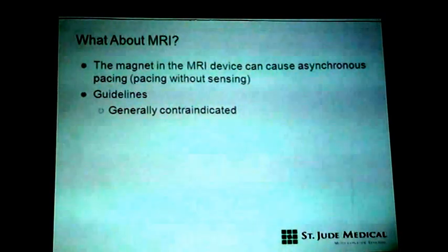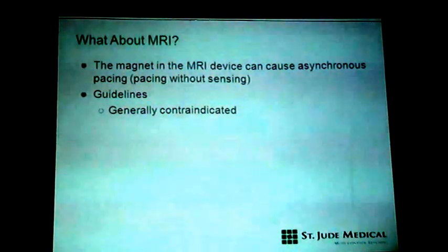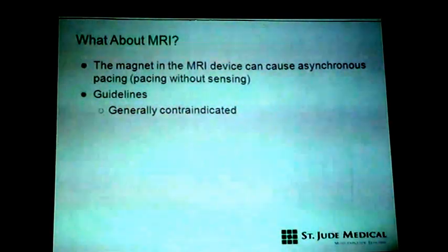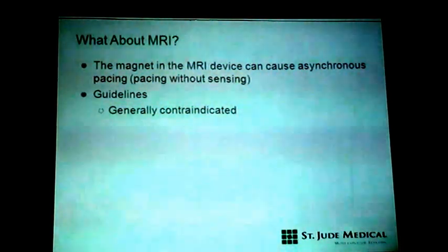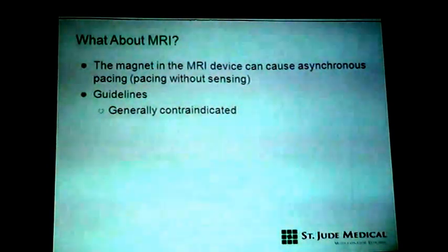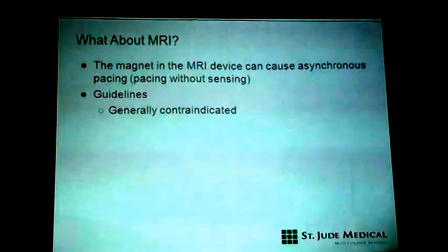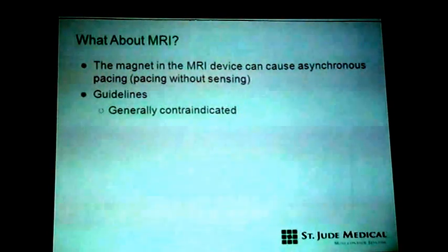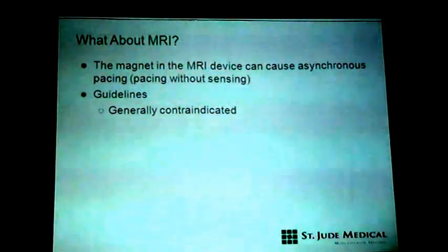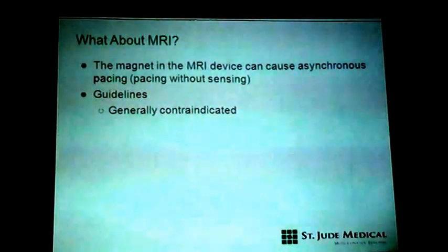And later, when we remembered, it was a blunder from our side, why we had done this. It started from the neurologist, and we carried on; our surgeon signed it, and I also signed it. We requested them two times, and later on it was absolutely wrong that we had sent him for MRI. The patient did not go, but it was a mistake. MRI is absolutely contraindicated.